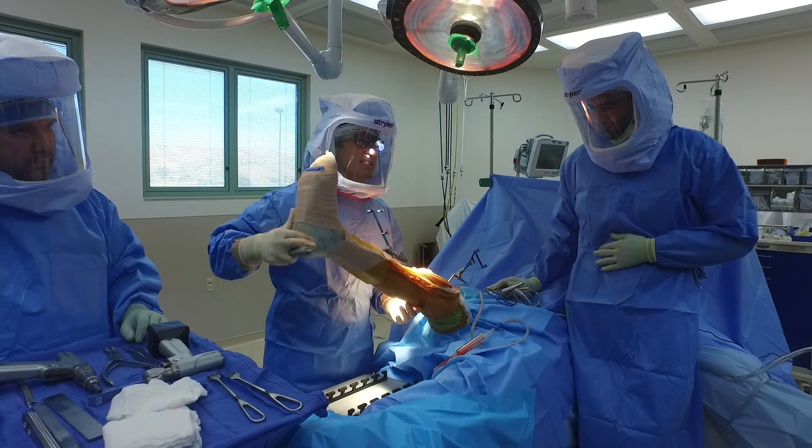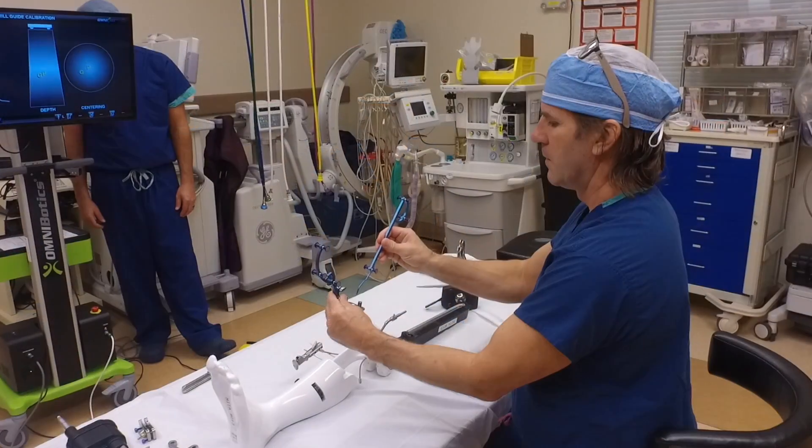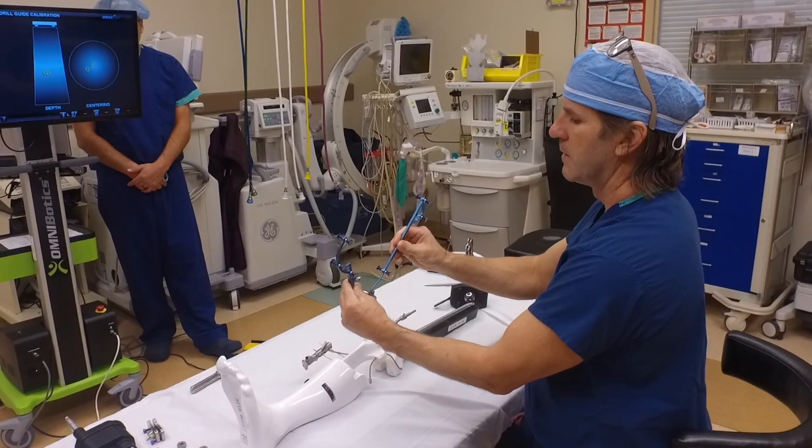Then we're going to show where the center of the hip is, where the ankle is, and where the position of all the bones are in the middle. I'm now using this electric pencil to calibrate these tracker balls to communicate accurately with the sensors.